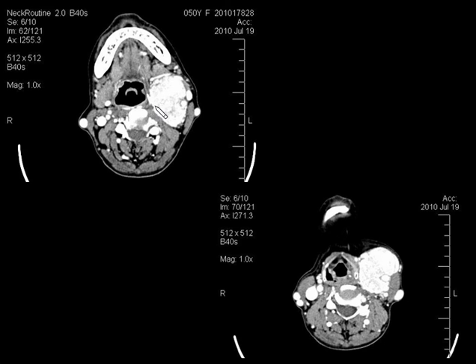Coming to the next case, you can see an intensely enhancing mass lesion at the level of carotid bifurcation causing splaying of the ICA and ECA. This is a classical case of carotid body tumor or chemodectoma — a highly vascular glomus tumor arising from paraganglion cells of the carotid body. These occur most commonly in the 4th and 5th decades, have a female predilection, and are the most common paragangliomas of the head and neck.